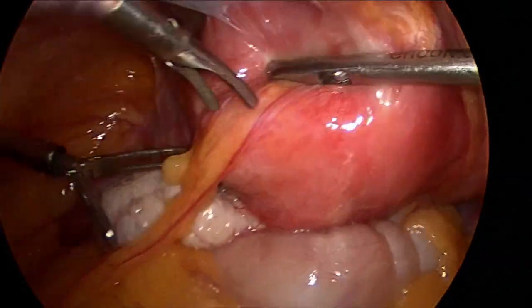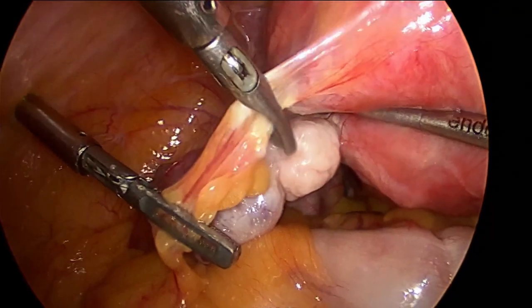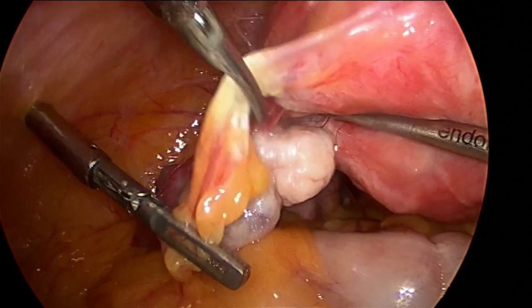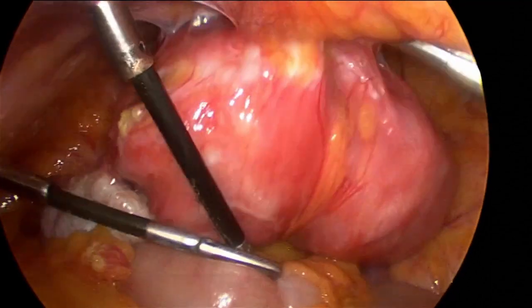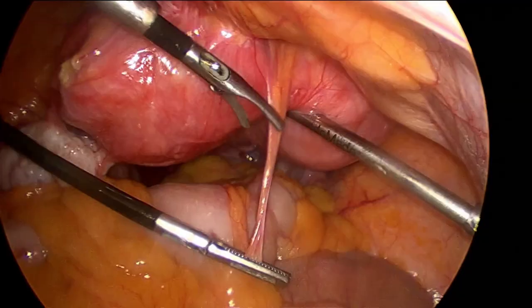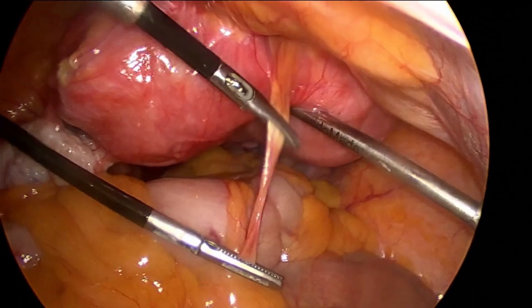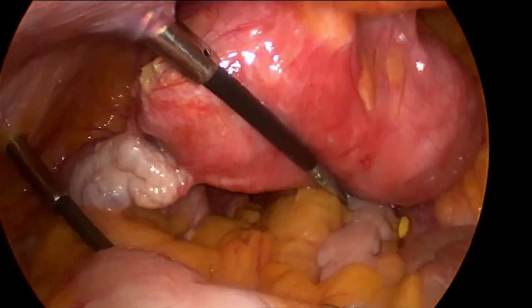First, we took care of the omental adhesions with the help of the bipolar shears, and we can see the posterior surface of the uterus was free.